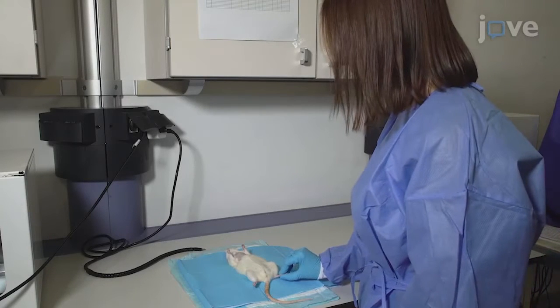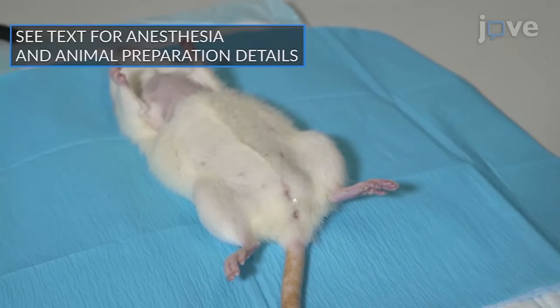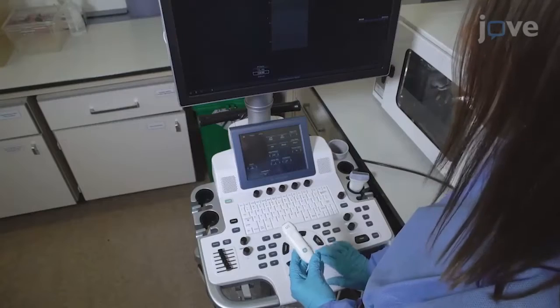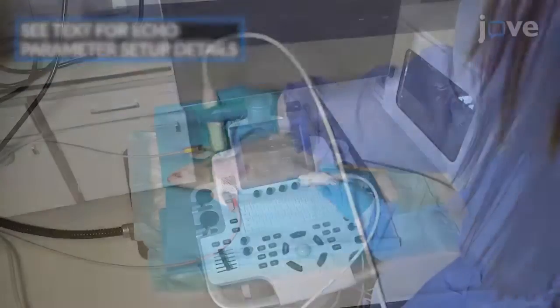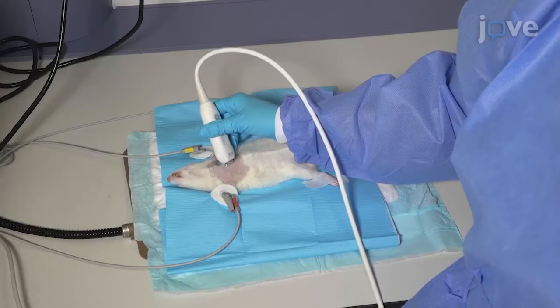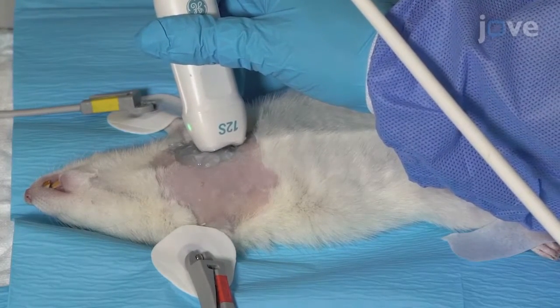After confirming a lack of response to pedal reflex in an anesthetized experimental adult rat, use conventional clinical echocardiographic equipment with a 12 MHz cardiac probe to position the probe on the left side of the sternum with the index mark turned to the right shoulder.